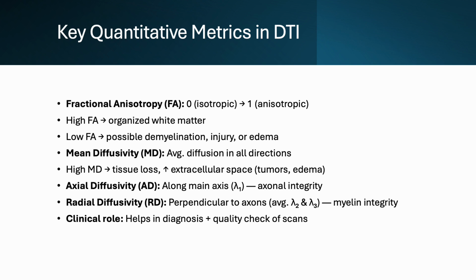So for us radiographers, knowing these metrics will help us detect if scan quality or artifacts might be present, which might end up influencing our results, so we can ensure we are giving out reliable, clinically useful data.